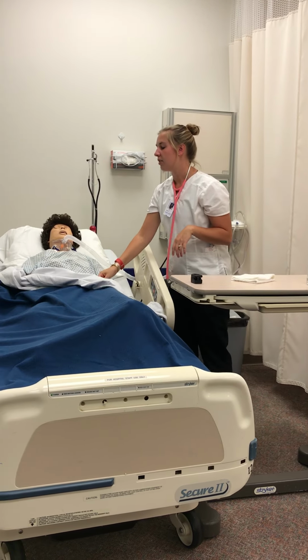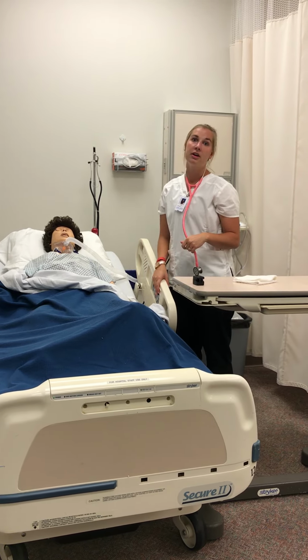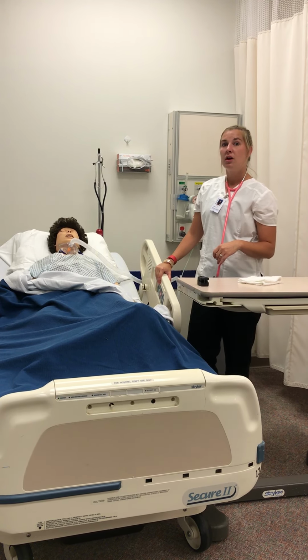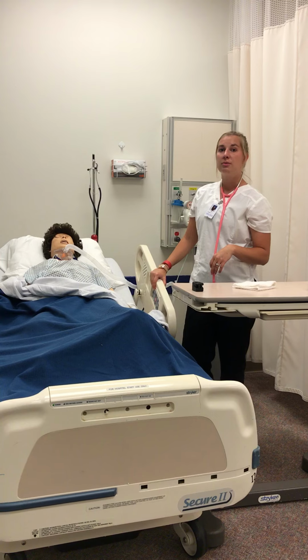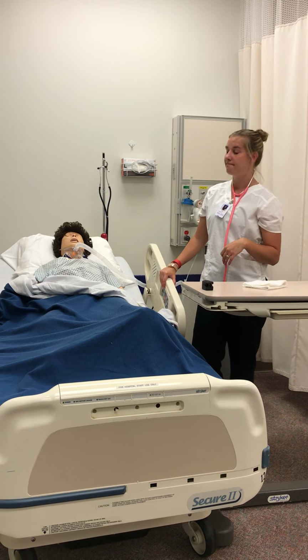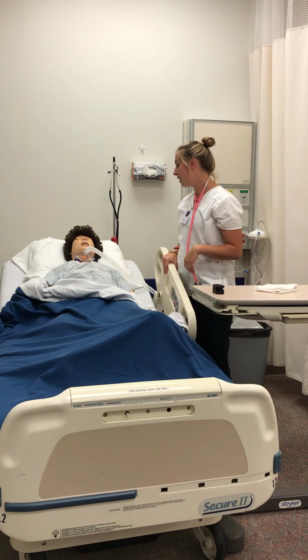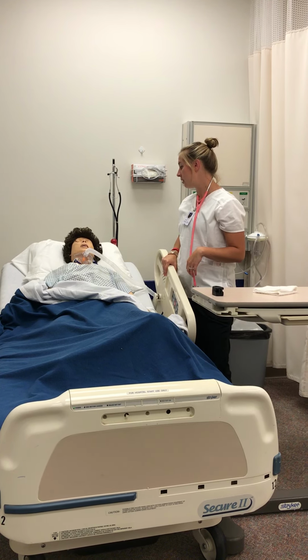And at this moment, her lungs sound nice and clear. If they do start to be rattling again, we would either resuction the trach, otherwise we would replace the trach for a new one. All right, Gretchen, here's your call light. Do you need anything from me? Great.